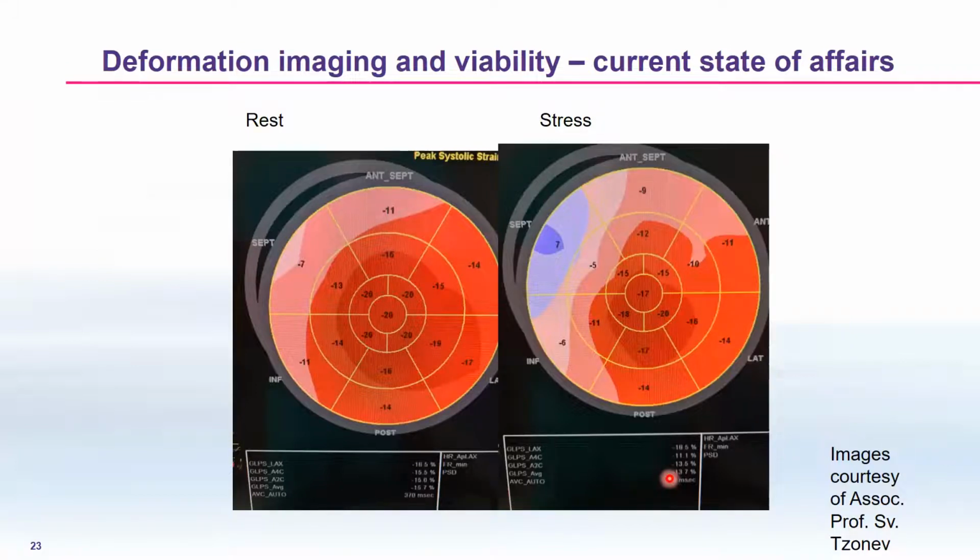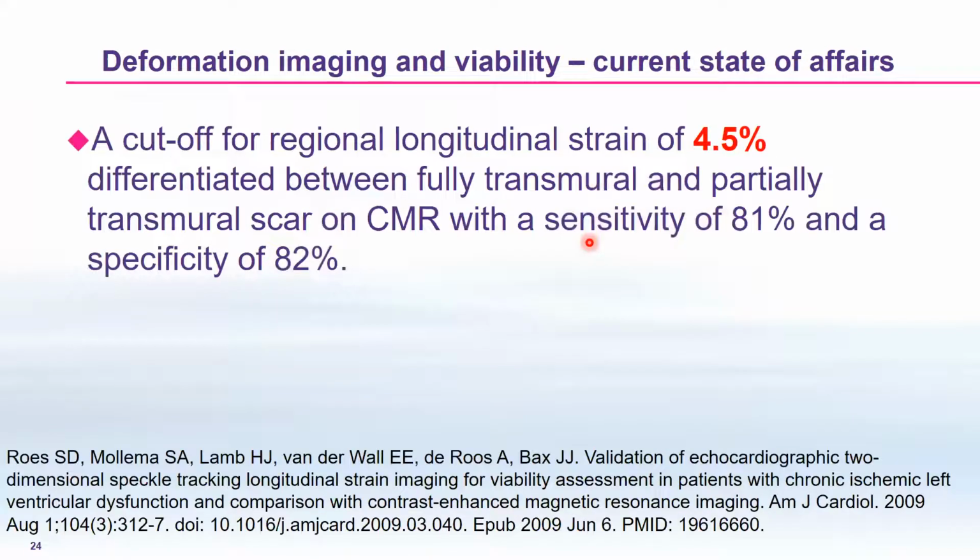The colleague is doing a stress test, he's asking the patient to simulate riding a bicycle, and then he's doing the GLS at rest before that, and then he's doing it after the stress. And here you can see such patients with clear ischemia in these regions. So this is another modification that potentially can be used.